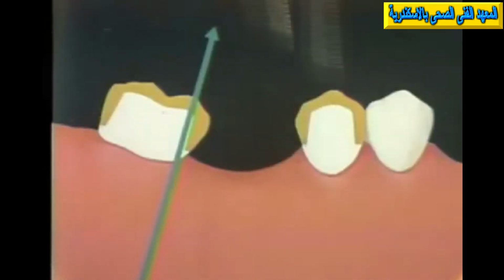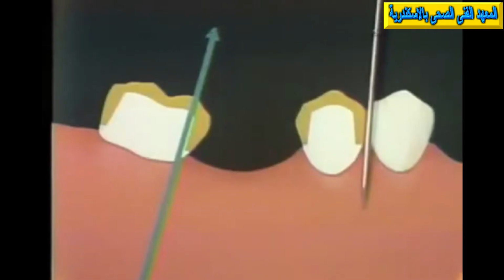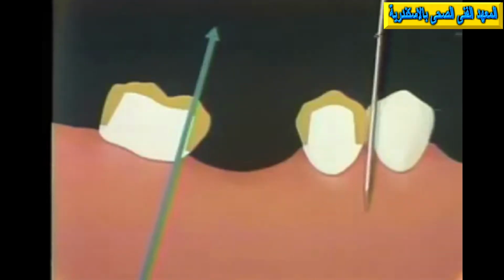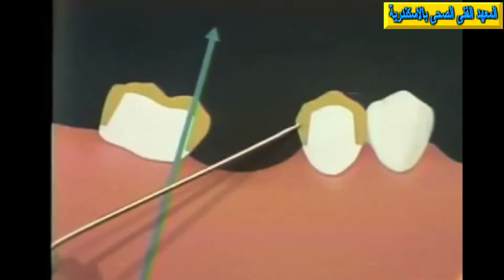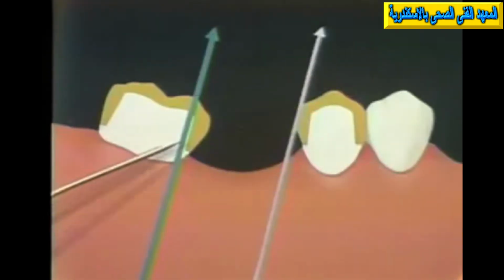Now, if I put a line in down there between that cervical and the contact point, I think you can see that that does not line up, is not parallel with the other arrow. So it would not be possible here to use fixed connectors between these two retainers. Now, by using a semi-rigid connector in this situation here, it's possible to cut the semi-rigid connector and parallel the line of draw of that connector with this mesial wall of the molar abutment here.